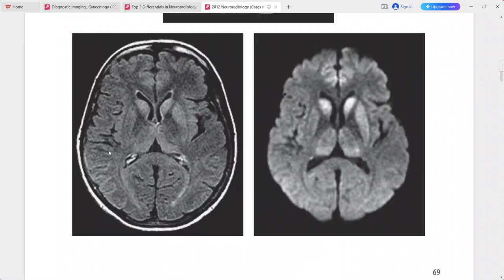On FLAIR and DWI there is nearly symmetric hyperintense signal within the caudate head and anterior putamen bilaterally, clearly demonstrated on the DWI sequence.